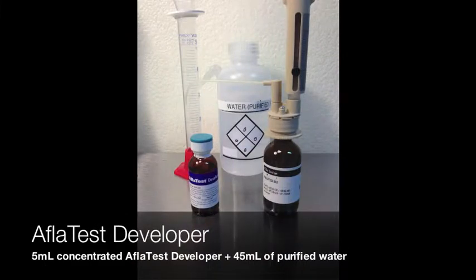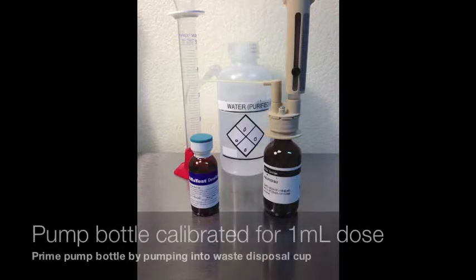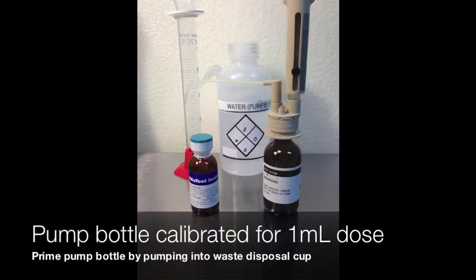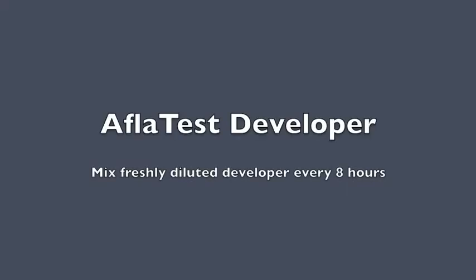Afla Test Developer is five milliliters of concentrated Afla Test Developer and 45 milliliters of water, and is good for eight hours. Be sure to use proper measuring technique and measure from the bottom of the meniscus when measuring out the 45 milliliters of water. Never measure from the top — this will produce an incorrect result. Afla Test Developer can be kept in the pump bottle for up to eight hours. Prime the pump by dosing twice into the waste collection cup.